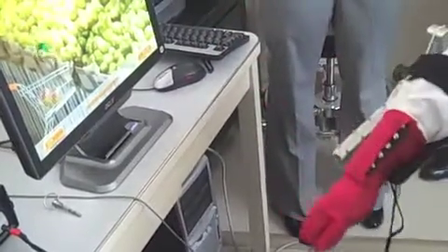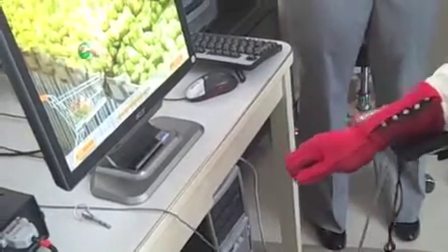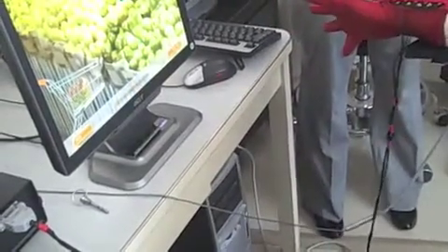At the same time, we can calibrate the glove the other way, so that it actually gives an input when the hand is open instead of when the hand closes. That way we can force patients, for example, to open the hand to clean a window or perform a game, instead of having them push.